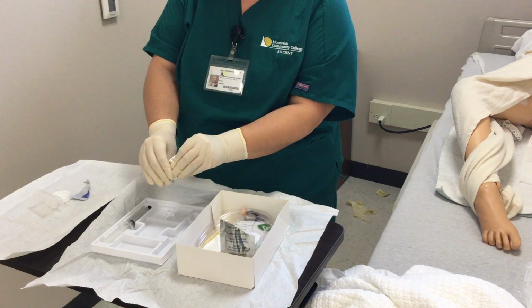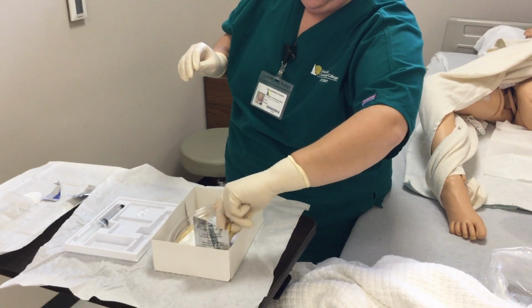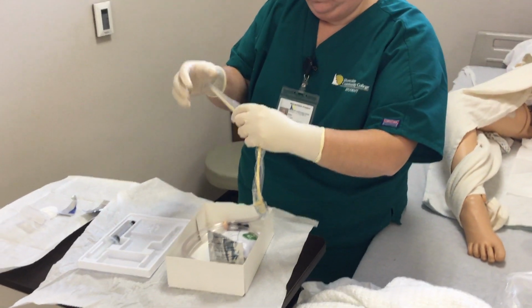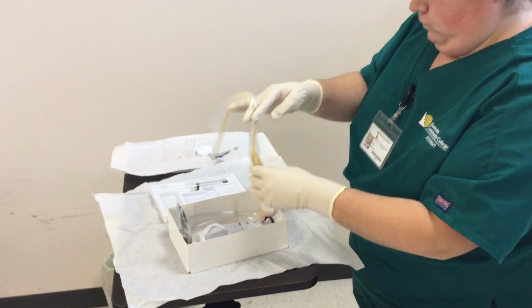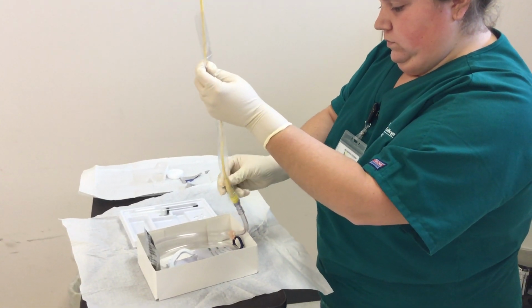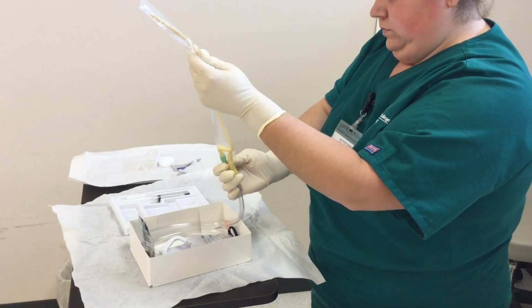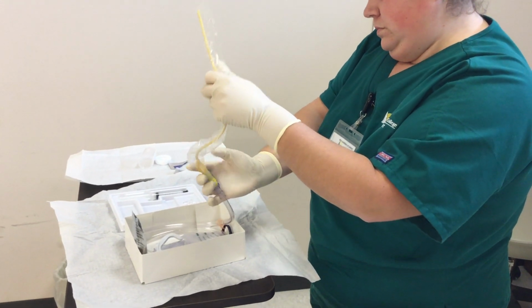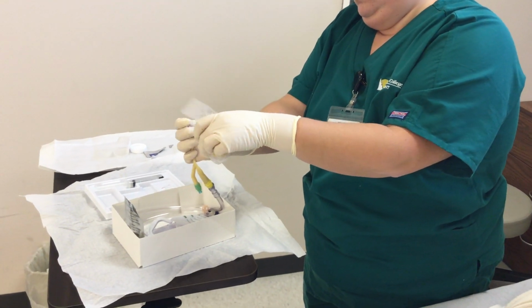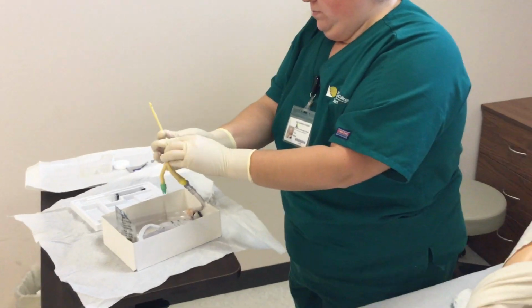So I'm going to leave that to this side. Okay, so I'm going to come around and take these gloves out.